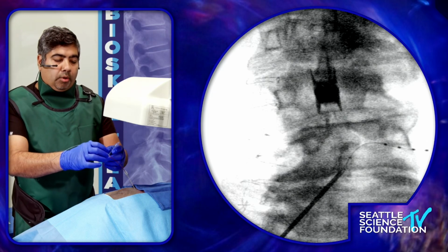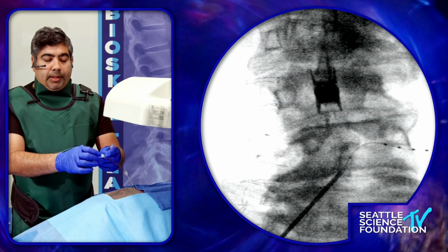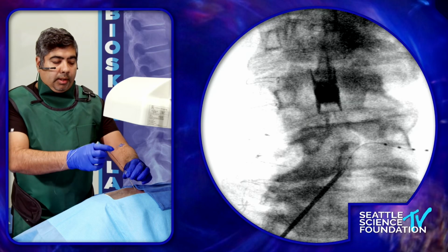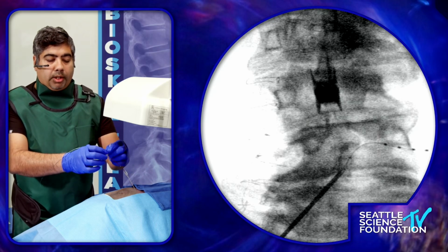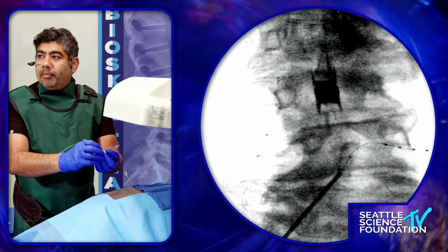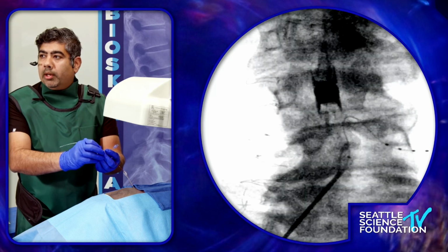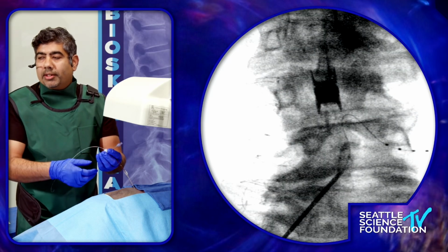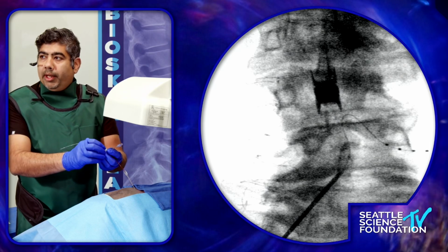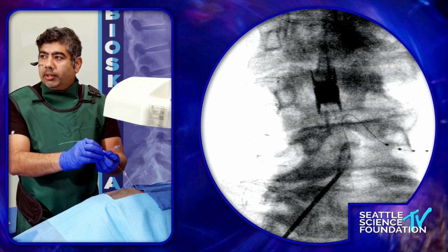So I turn everything to 12 o'clock. By everything, I mean the needle and the sheath are married to each other. So if the Tuohy needle faces 12 o'clock, the sheath also has to face 12 o'clock. You can look here. And then I'm going to basically push the lead in so that I can get my top loop. How high do we go? The general consensus is if you go to the superior end plate or the disc level, that's a pretty decent height of the top loop, or the superior loop, which is required to stabilize it.